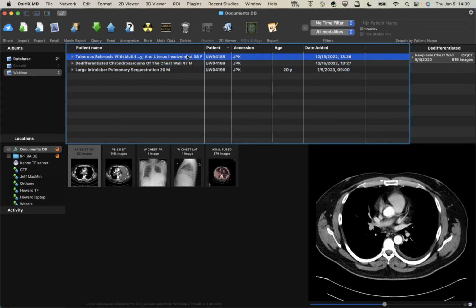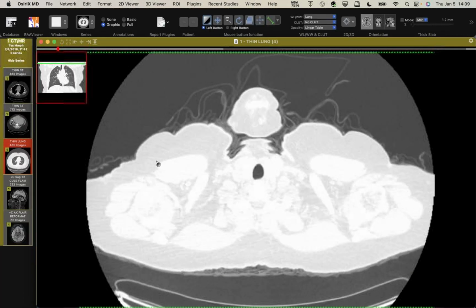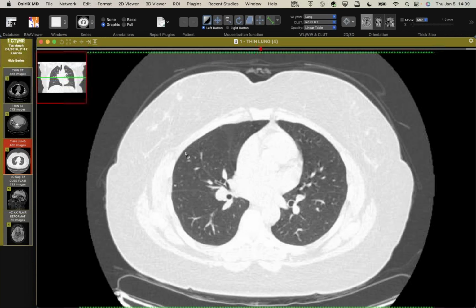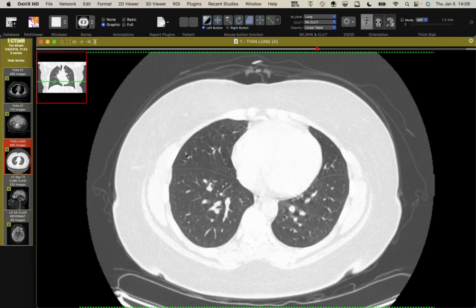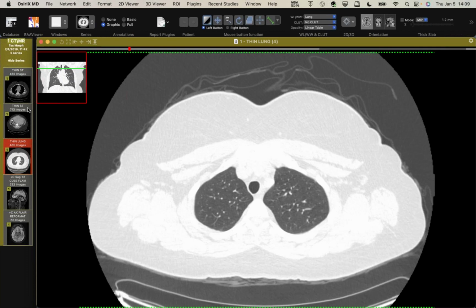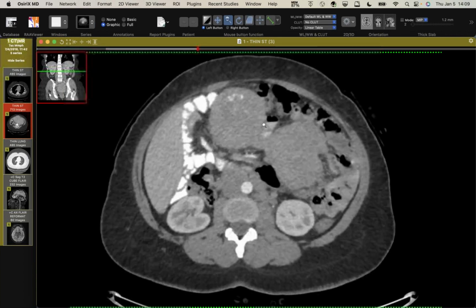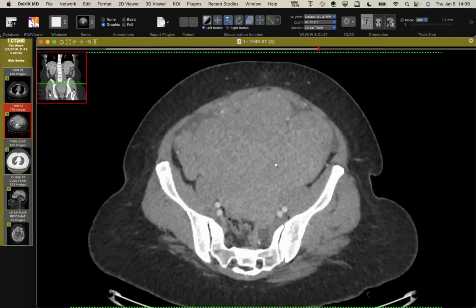Right. Yeah. Good point. All right, and then this is a fun case. This is, I can't remember how old, but I think a middle-aged female patient who carries a diagnosis of tuberous sclerosis complex and has a nice collection of findings. Let's see if I can find them all. So first of all, this is an abdominal CT. She does not have any AMLs, but she presented with this giant pelvic mass.